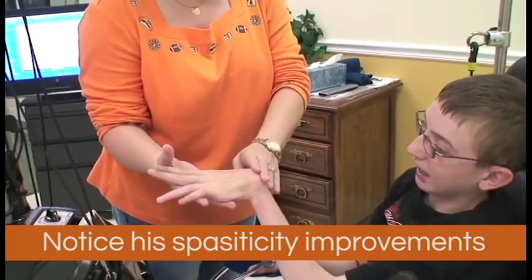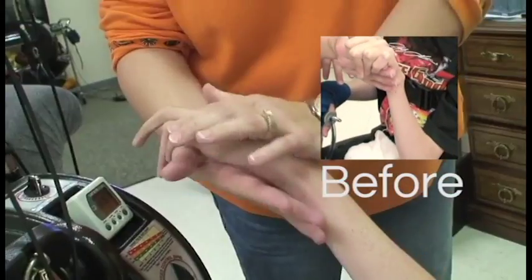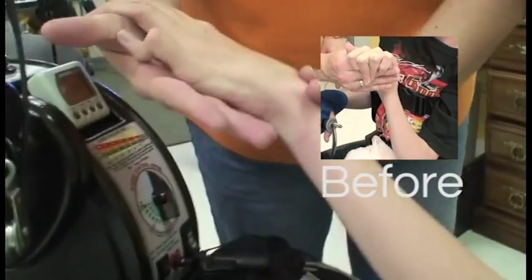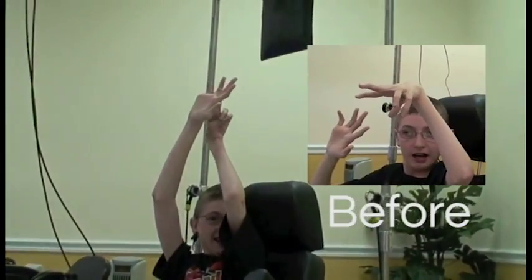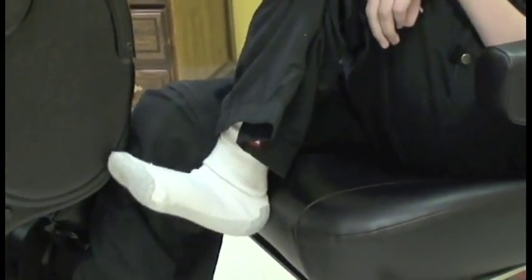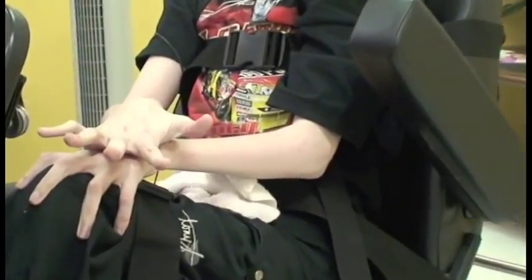How does it feel? Oh, it's wonderful! Look at his fingers — they're out. When we filmed him before and straightened his wrist, his fingers — that's amazing. Pick your leg up. That's quite a bit of movement, I can see a lot of difference. His left hand can straighten out and his feet are moving.